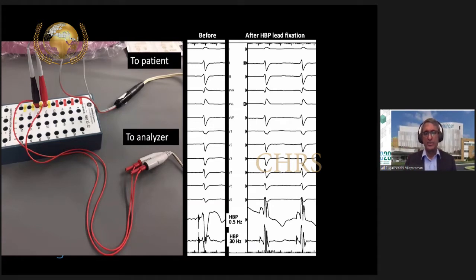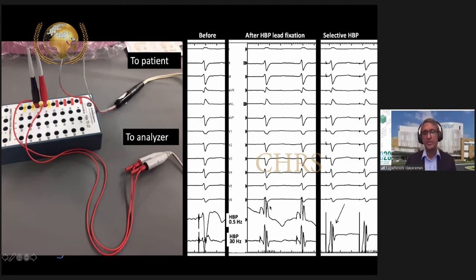You can record atrial His electrograms during implantation just from the PSA itself, and display them along with the 12-lead on a recording system. An additional channel with a different filter setting is helpful — the high-pass filter is changed to 0.5 Hz from the traditional 30 Hz. This allows you to record the His bundle injury current, which is important for obtaining excellent pacing thresholds. In this situation, you can see there is no ventricular injury current, so you get selective His bundle capture.